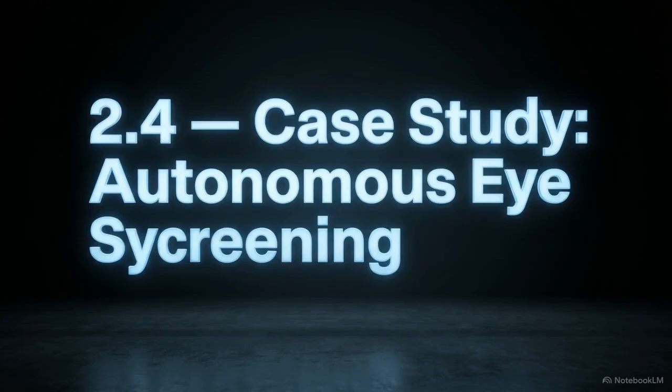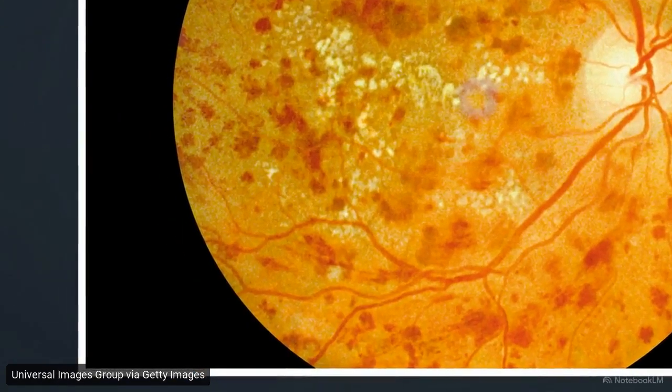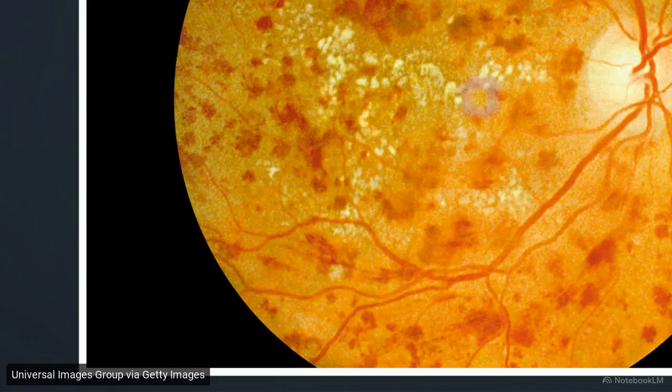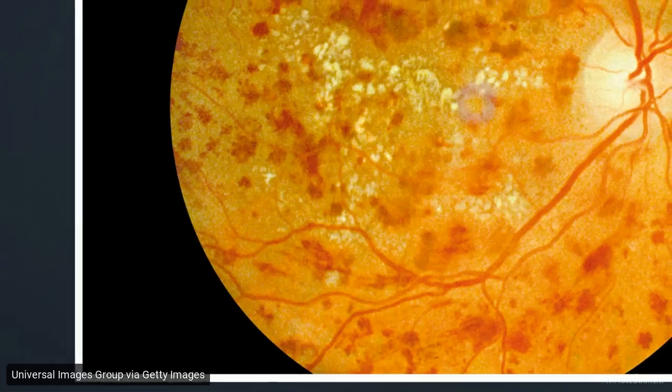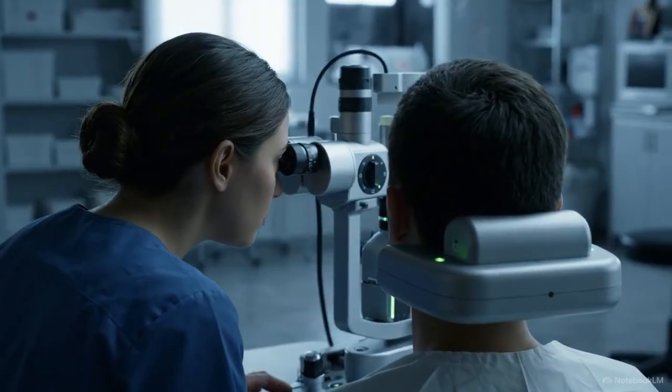However, there is a rare exception to the rule. This scan shows the back of a human eye. Doctors are looking for diabetic retinopathy, a leading cause of preventable blindness. In 2018, the FDA cleared Luminetics Core as the first AI device allowed to deliver a diagnosis autonomously, without a specialist. The workflow is designed for primary care.